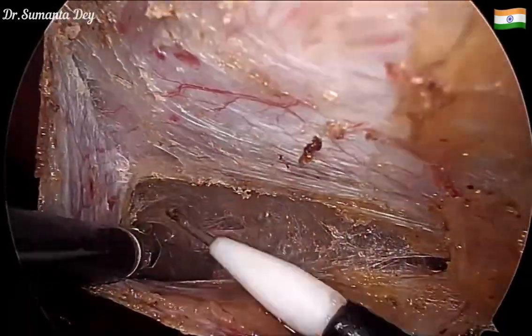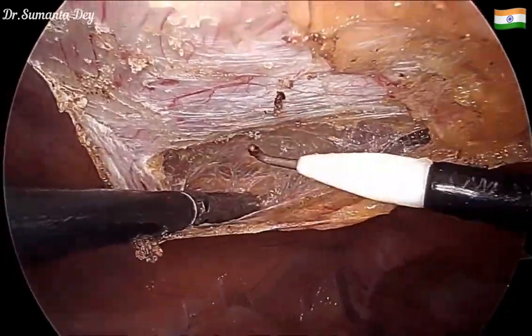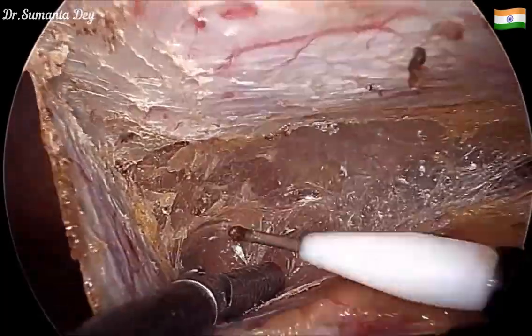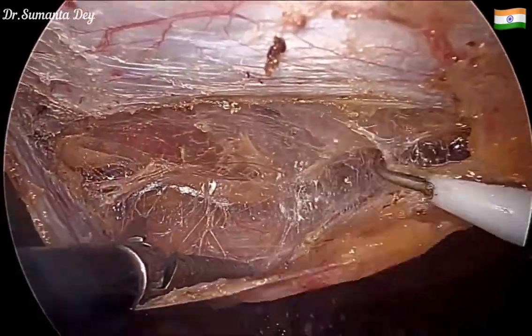You have to be very cautious not to make any undue rent in the peritoneum. You can now clearly see the arcuate line, beyond which there is only fascia transversalis and preperitoneal fat.